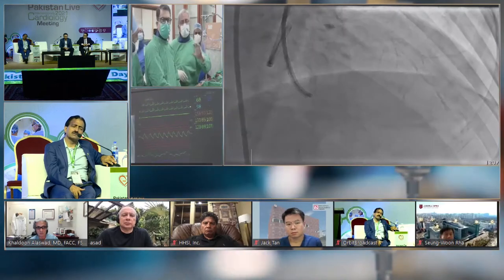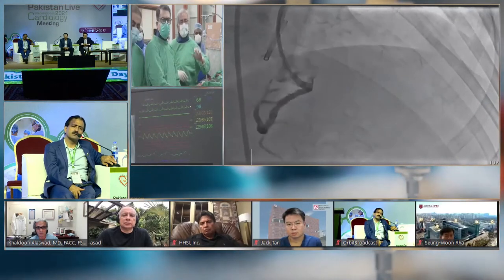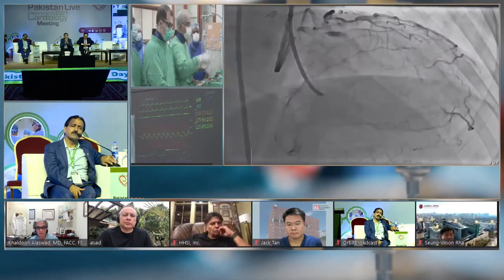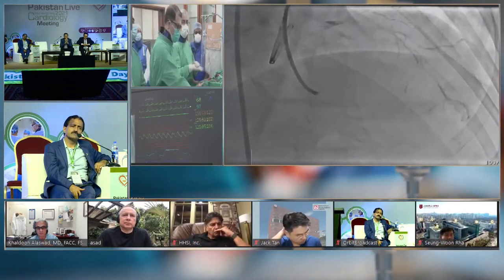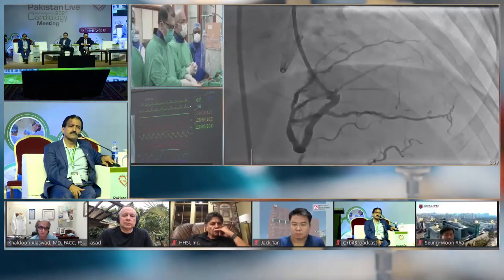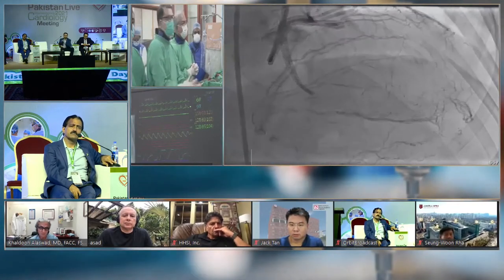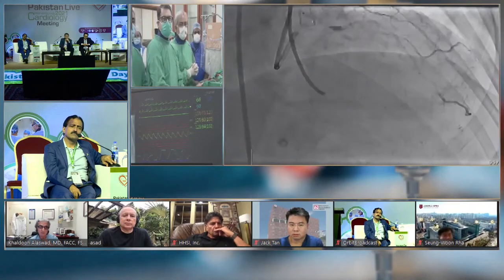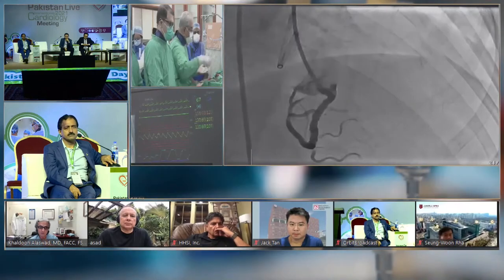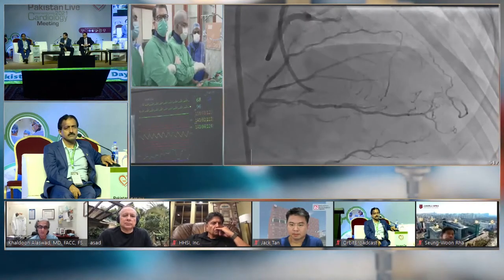Swail, why 7 French? Why 7 French? Well, because it's going to be a CTO. We'd have to do trapping. We'd have to do exchanges. We'd have other supports. We might end up with a bifurcation because there's a bifurcating lesion beyond the LAD. So we have to be ready for a bifurcation. We need a lot of equipment going in there. So I feel much more comfortable with the 7 French.